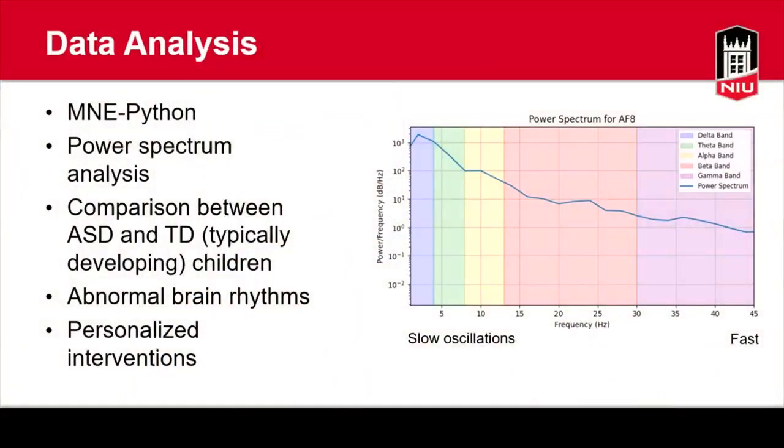When you do this power spectrum analysis, is it over an entire recording? Can you tell us a little bit about the analysis? Yes. This part we also work on with another professor, Dr. Cho in mechanical engineering, and he is in charge of signal processing and machine learning. Very good question. One simple way is that each task is 15 seconds or even 10 seconds, so we look at it entirely.